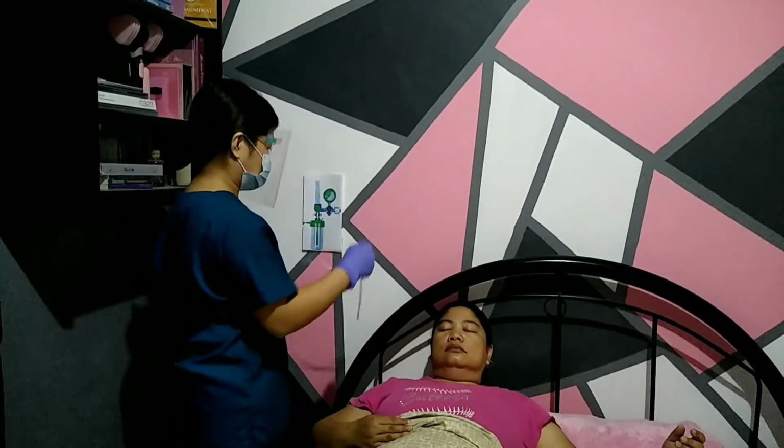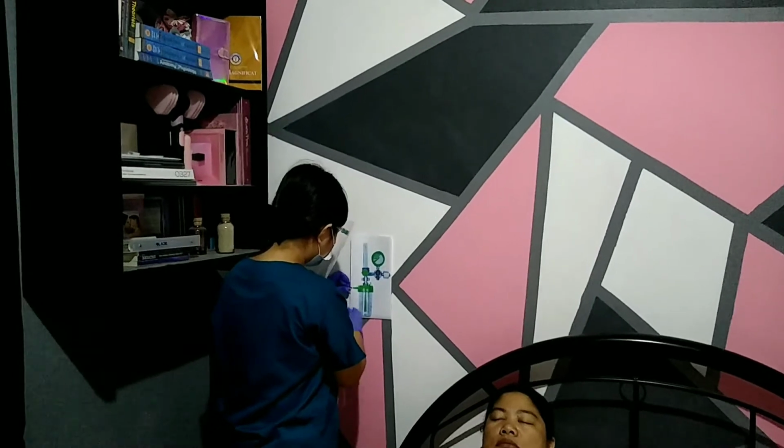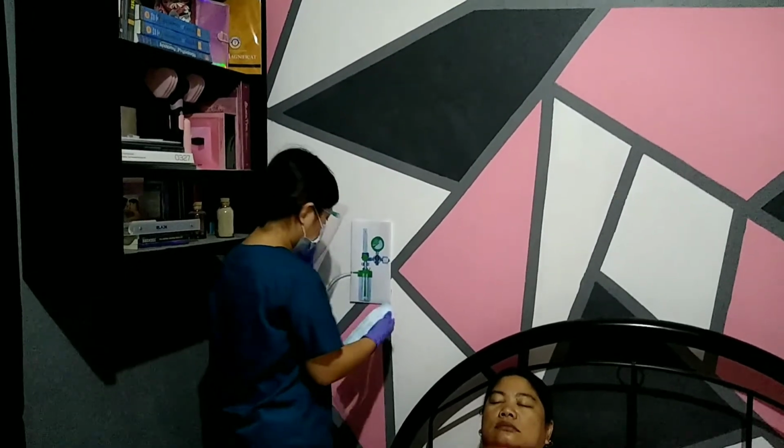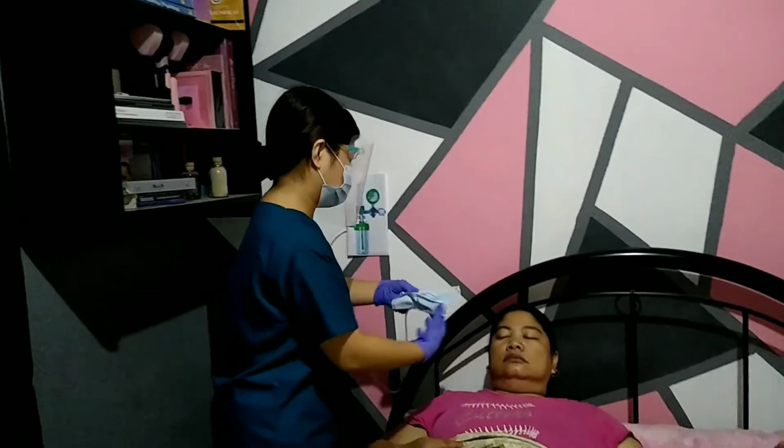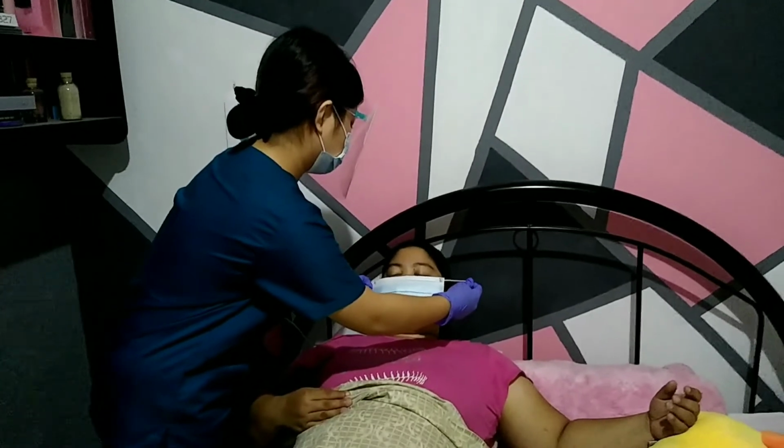And then next, we are going to use the face mask. Attach first the tubing to the humidified oxygen source. And then you can now apply the mask over the patient's mouth and nose.